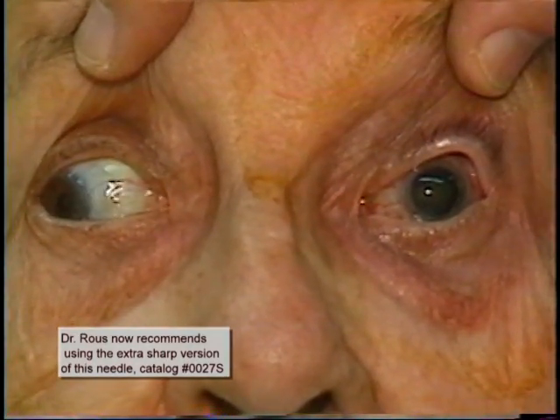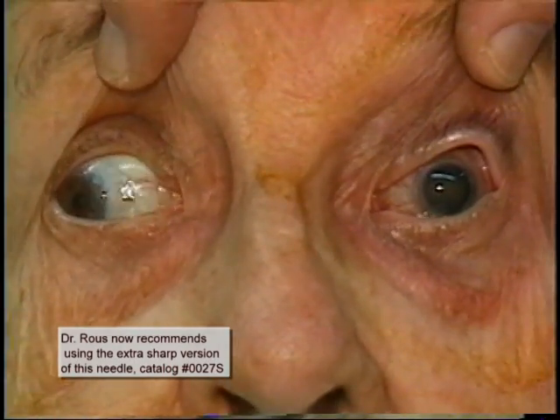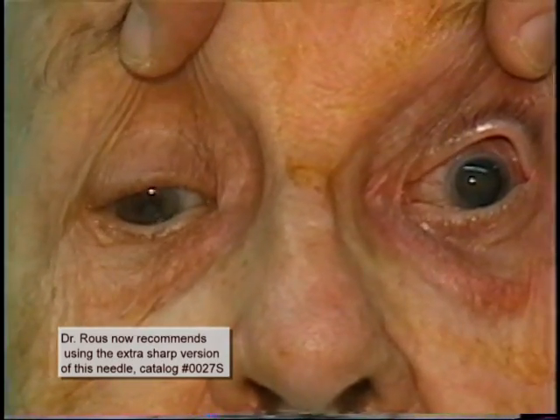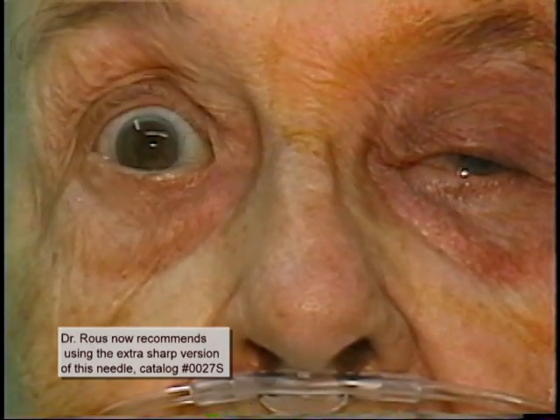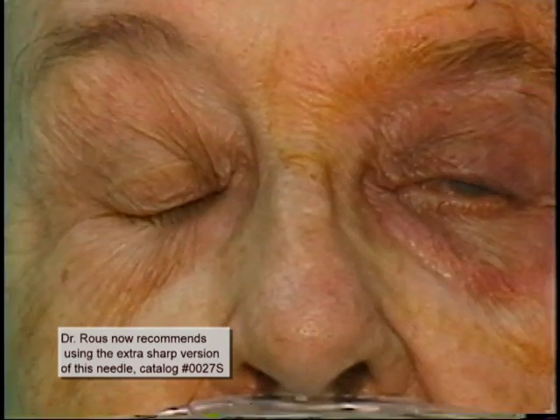Here we are again in the OR about 10 minutes later; some additional digital massage has been done. Again, notice that we have achieved excellent akinesia. And a fairly good lid block has taken place, again just from the sub-Tenon's injection.